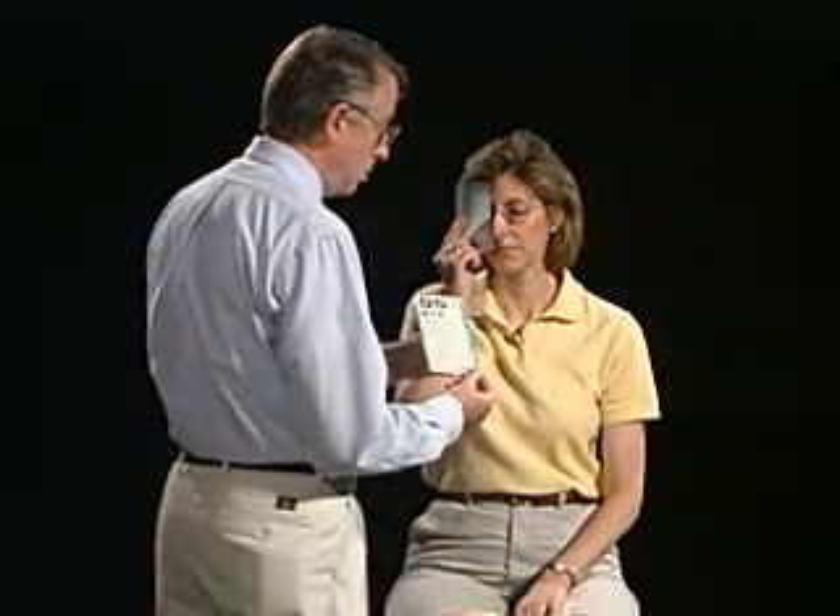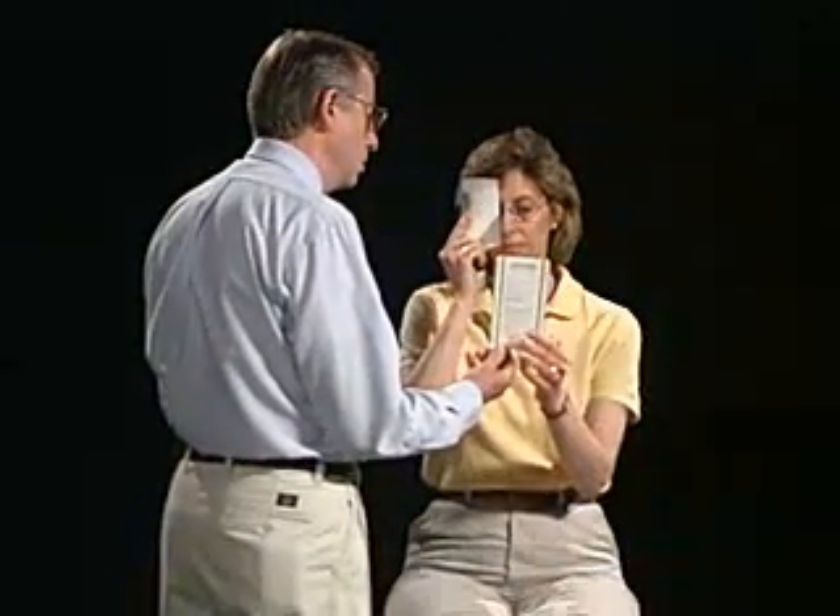During the visual acuity, I want you to wear your reading glasses and hold this card over your right eye. We're going to use the pocket Snellen chart, and I want you to hold this in your own hand so it's comfortable — at the length of focus for you — and read the smallest line. Which line can you read?